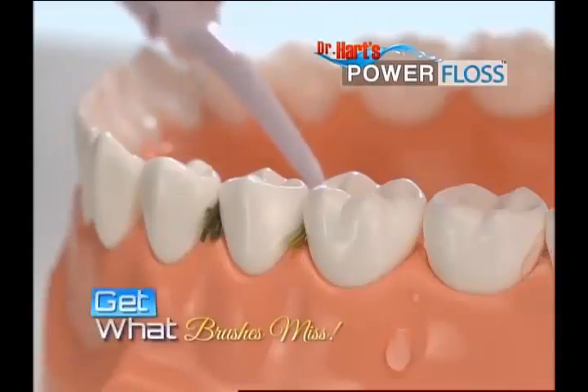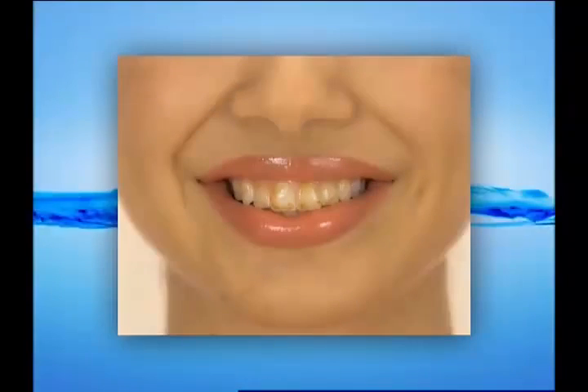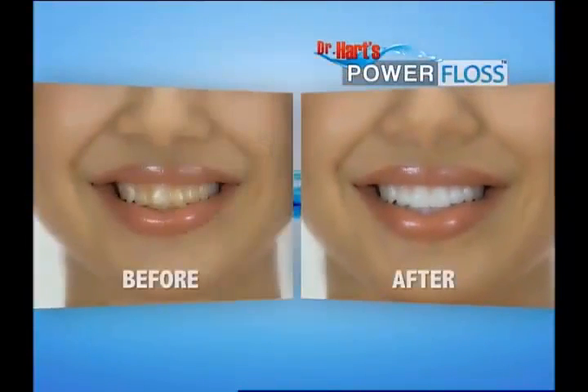Power Floss gets in between teeth to get out what brushes miss. Just watch this — these teeth are covered in fresh coffee. Look how Power Floss quickly blasts it away, leaving them clean, refreshed, and free of debris.